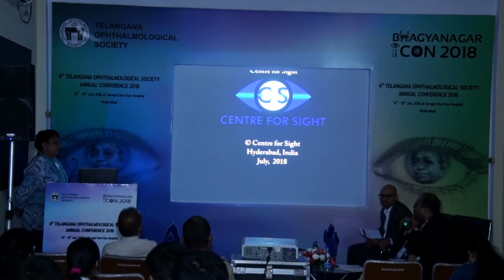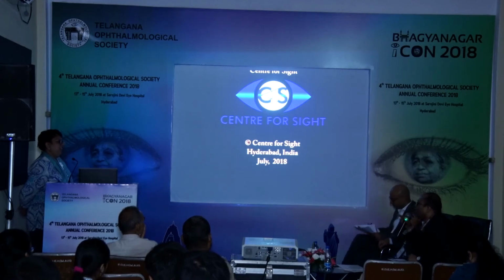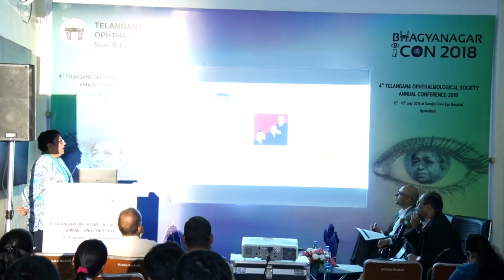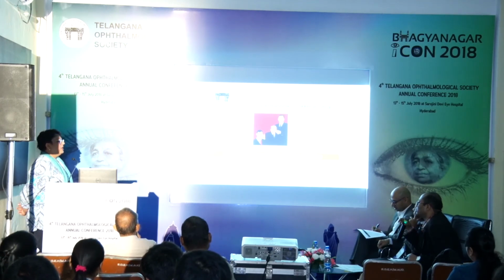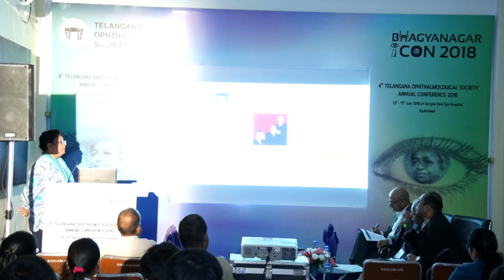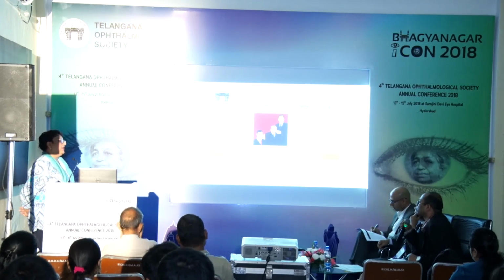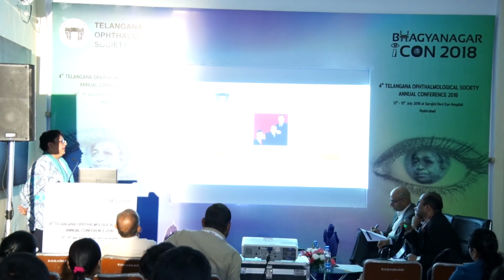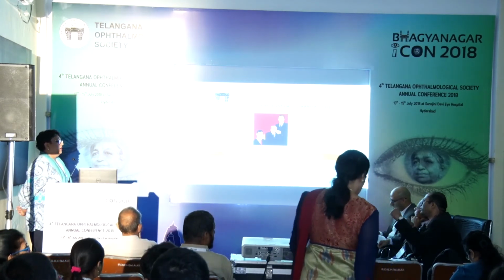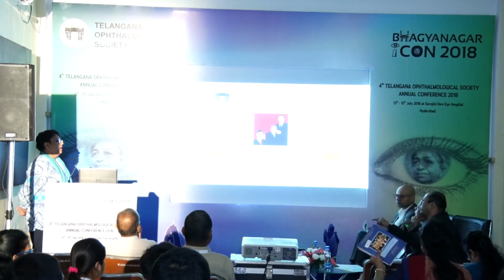It's a wonderful video. So, how did you manage the intraoperative bleed? I mean, how much time did it take to complete the surgery? It did not take long. It's just that when the bleeding stops your view, you just aspirate the blood, irrigate and aspirate it away, and then you restart from where you left off. So again, you have to put the lens and then again relocate each area.